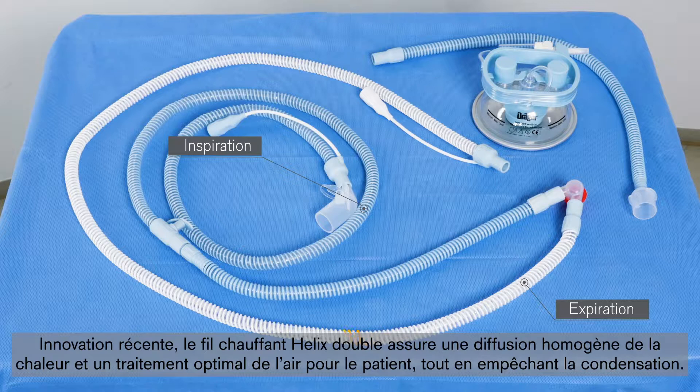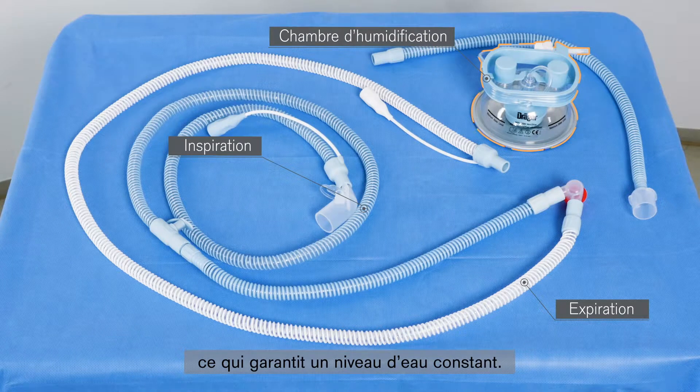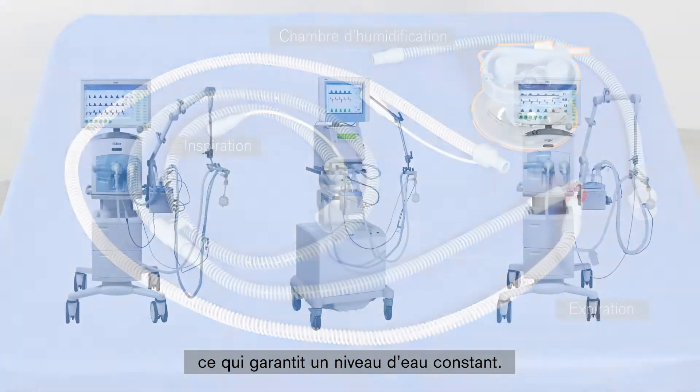The newly integrated double helix heating wire ensures consistent heat distribution, optimal conditioned air for the patient, and prevention of condensation. The humidifier chamber for premature infants has an automatic feed mechanism as an integral part of both sets and ensures a constant water level by means of an auto-feed mechanism.